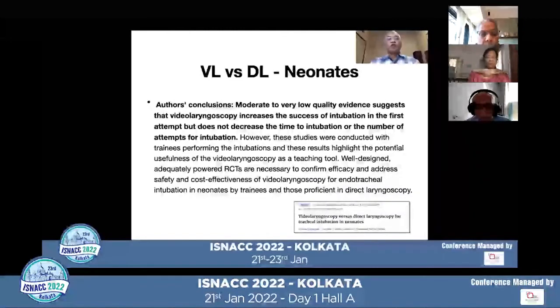For video laryngoscopy versus direct laryngoscopy in neonates, the authors concluded that there is moderate to very low quality evidence that video laryngoscopy increases the success of intubation in the first attempt but does not decrease time to intubation or the number of attempts for intubation.